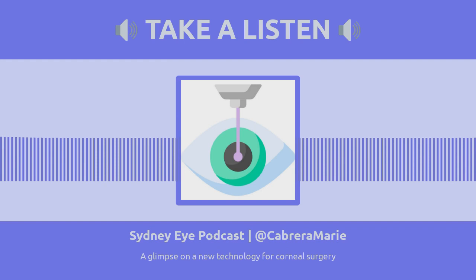Is there any limitation in the size of the wound? We're hoping that this technology will have unlimited wound size consideration, but because this is only early stages of our characterization, we haven't made the wound really, really big. As a starting point, we are only targeting smaller cornea incisions now. So those small ones that we often see in cataract surgery, they're usually between 2 and 3 mils. That's a perfect target for what we're hoping to use it on. So if that makes sense. I would say we have endless possibilities, but we're only starting small.